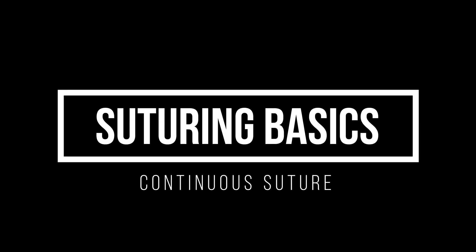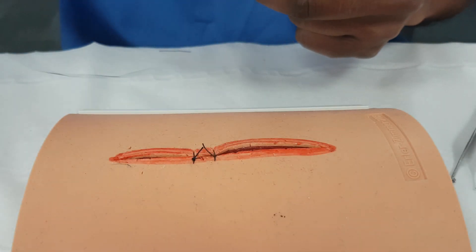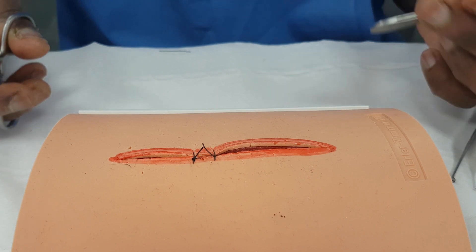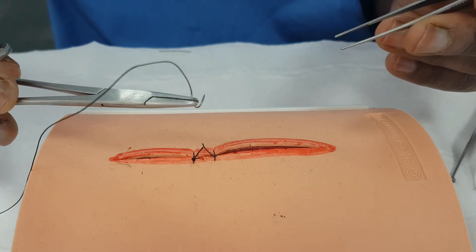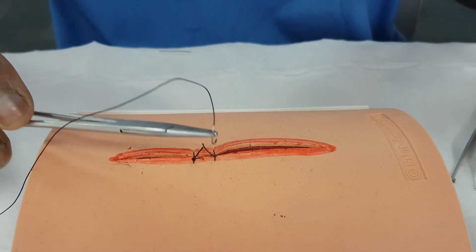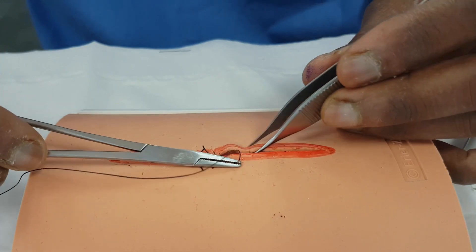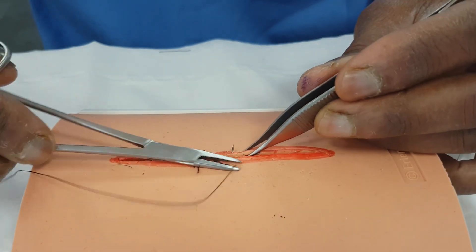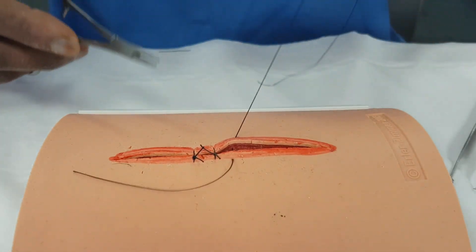What we could do now is change that and decide to do a continuous stitch. That's where we go from one end to the other, and we'll try and do that now for you. Same thing again with the needle holder. Needle's in the right place, all mounted up. And we would start from one end, going with the curve of the needle, the curve of the needle coming out the other side, avoiding the tip when I pull it through, bringing my material through.